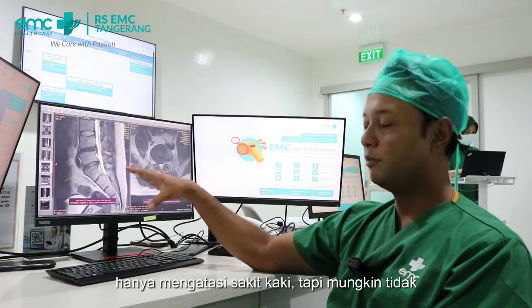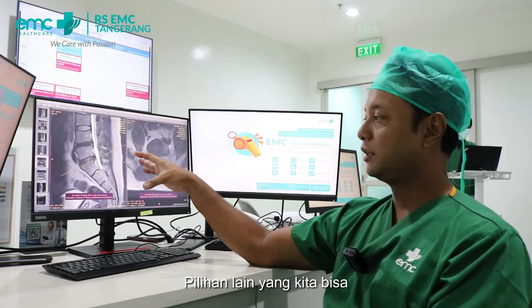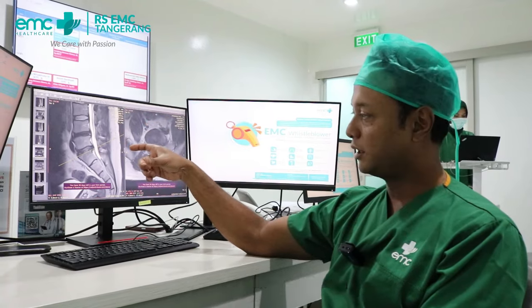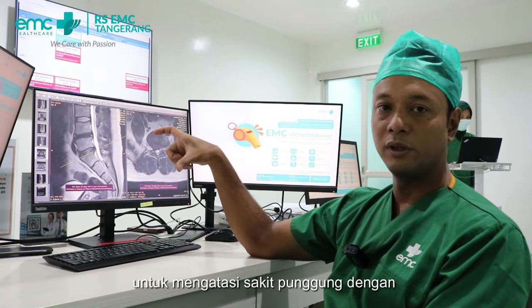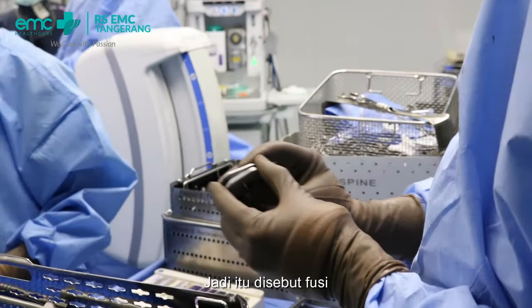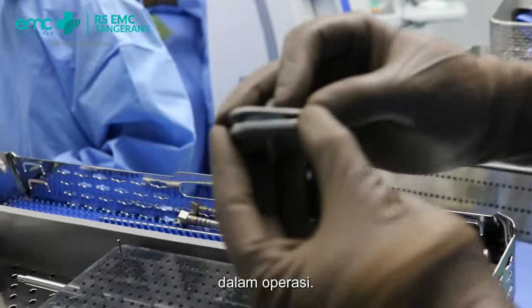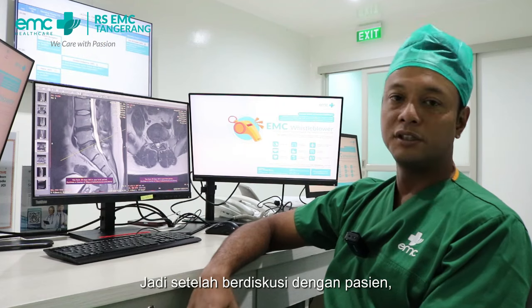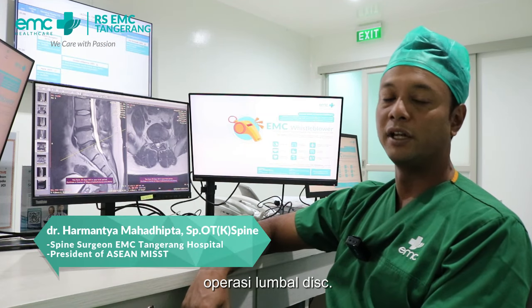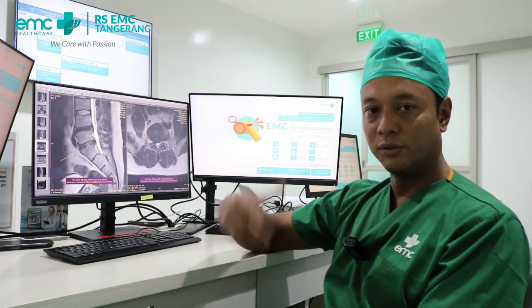Another option is to replace the disc — we can replace it with a cage, which is called fusion, or we can do a lumbar disc replacement surgery. After discussion with the patient, he decided to do the lumbar disc replacement surgery. Let's see what that involves.